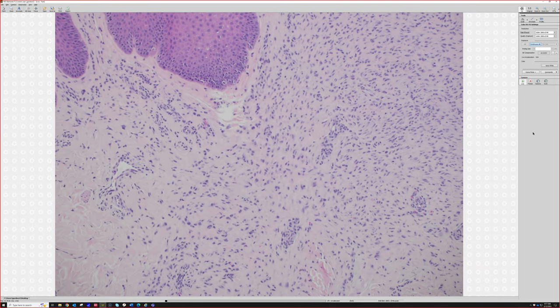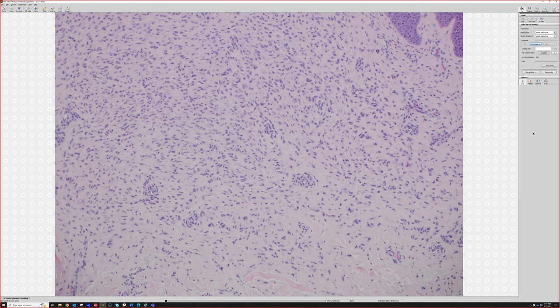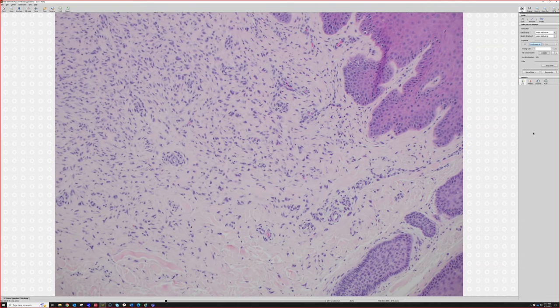Right. So that's a little confusing because that sounds like dermatofibroma's other name is benign fibrous histiocytoma, right? Those are identical things. Benign fibrous histiocytoma is dermatofibroma. But epithelioid fibrous histiocytoma is actually now thought to represent either a different variation that has a different molecular pathway or just a totally different tumor. I kind of favor the latter because they usually have a good bit of difference. This one does look kind of like a DF, though.